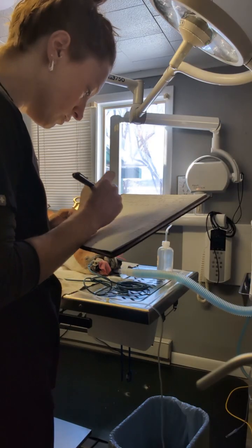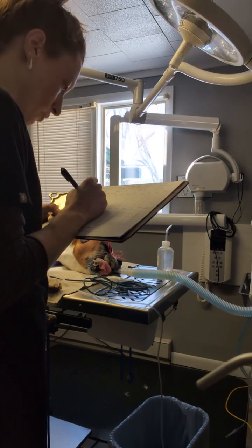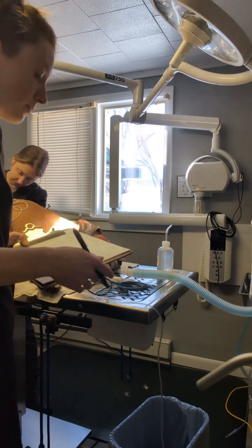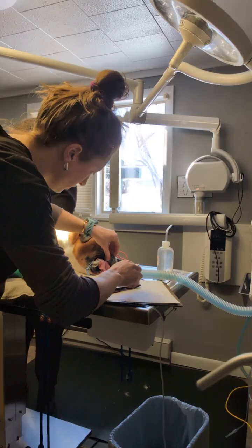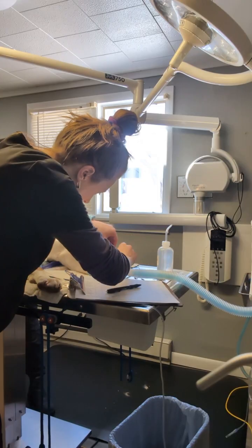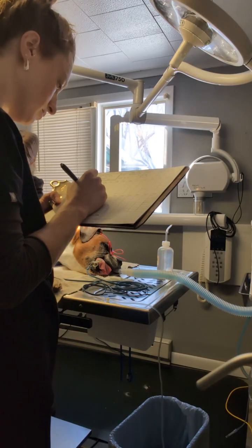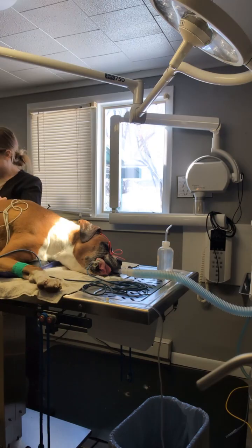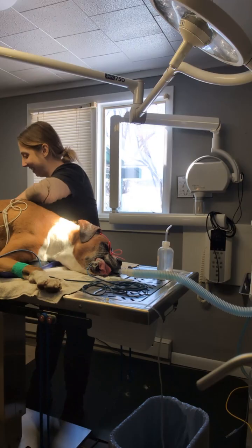About 8 respiration rate. Just reset the blood pressure cuff. So once that gives me a number, I can mark that. And I will check the capillary refill time and mucous membranes manually. Those are less than 2 seconds, nice and pink. And it says 76 degrees, so I don't believe that. I'm going to manually check the temperature as well.